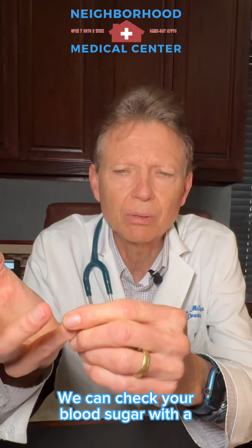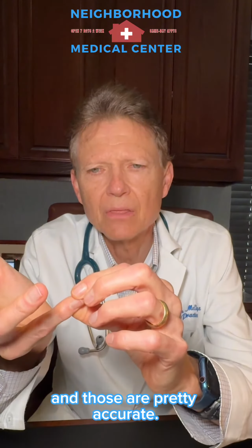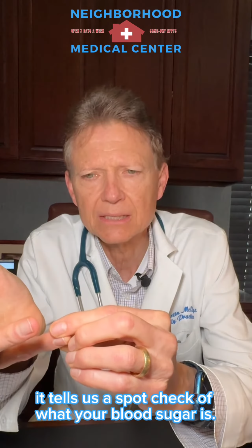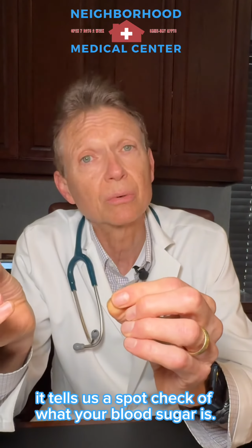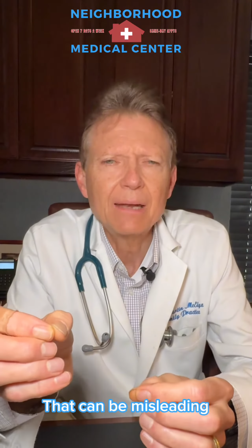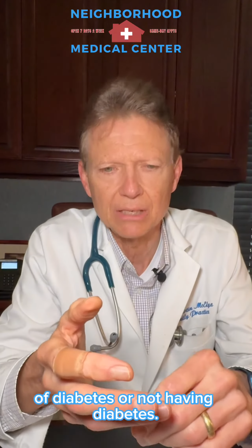We can check your blood sugar with a finger stick blood sugar check, and those are pretty accurate. The problem with that kind of blood sugar check is it tells us a spot check of what your blood sugar is. Right now, today, your blood sugar is a certain amount, and that can be misleading when you're trying to give someone a diagnosis of diabetes or not having diabetes.